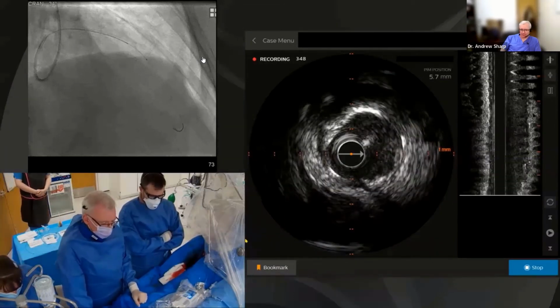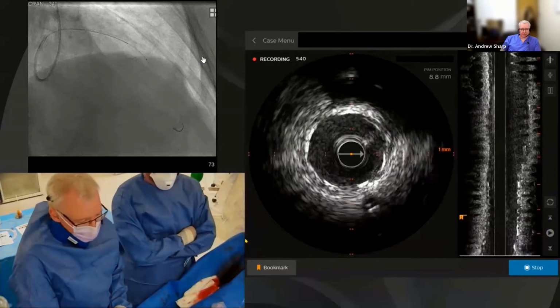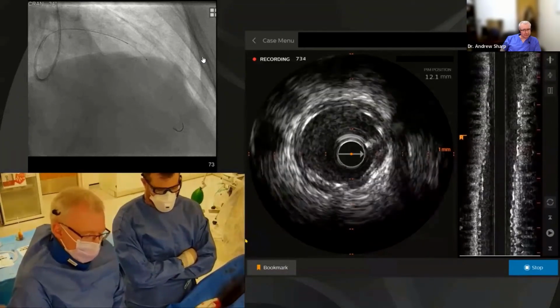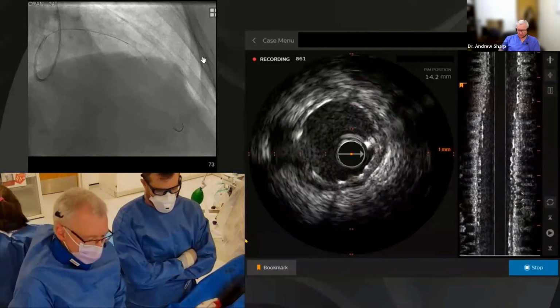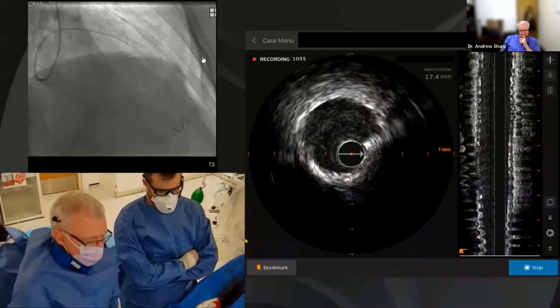So our exit is perfect, and we've got a bigger stent there. I think we can appreciate that this is much better expanded. We've got uniform expansion. It's a nice round stent because we've gone to higher pressures. At the moment, I'm extremely pleased with this. There's that segment that didn't quite go up, so we'll measure that in a minute.